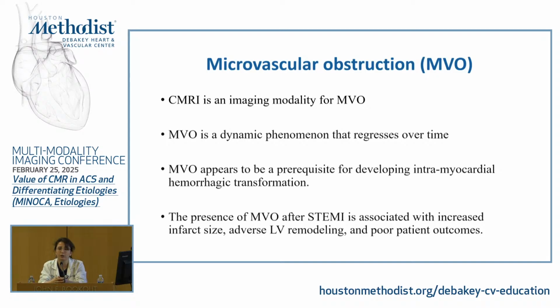Timing-wise, I saw all different times in the literature. It can persist up to one month to a couple of months. Sometimes in patients with ventricular ablation, when we repeat the MRI a couple of months later for different reasons, we can see that the scar is now a little bit denser, maybe a little bit smaller, because of the edema cooling down.